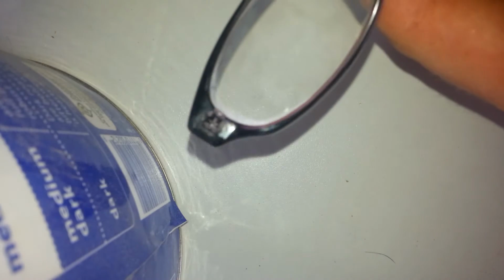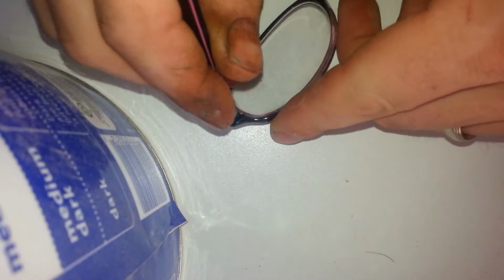So, if we look closely, there's a couple, 1, 2 slots in there that these 2 slots need to slip into. In order to get them seated back in there, you have to heat up the plastic. It won't sit in there all the way, so we put it in there.